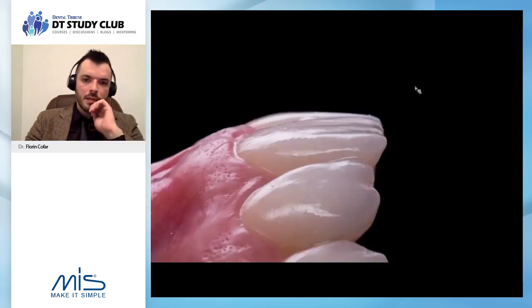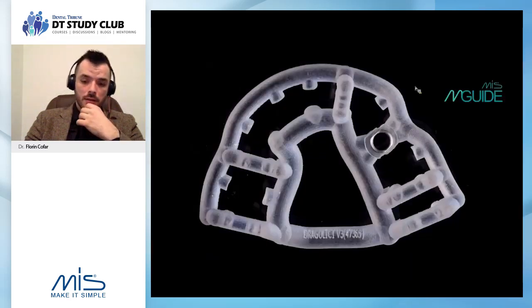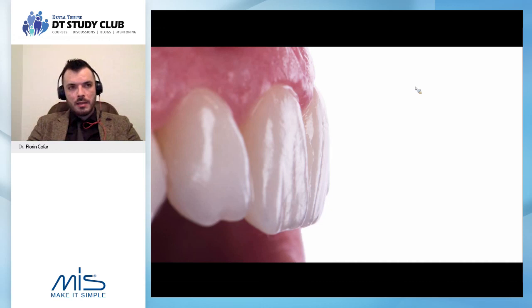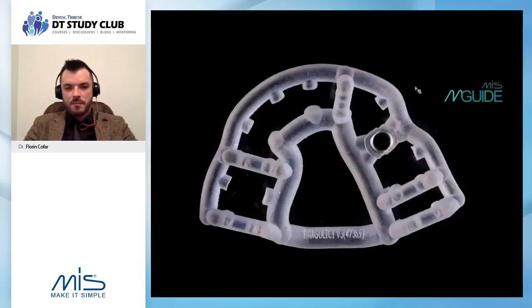You can see the morphology and the geometry that, as I told you, is a natural one, so there was no man-made design involved. And then, because the implant position is related to the final design, at this point we can simply either send the STL with the design for the implant guide, or you can scan it out if you want to be, let's say, more safe. But more or less they should be the same, at least in this kind of workflow where geometry stays the same.